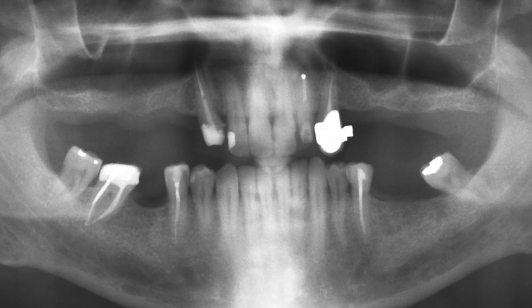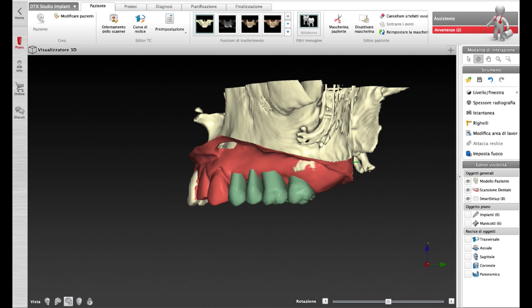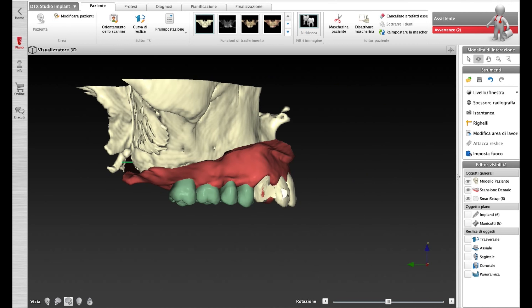Male patient missing all maxillary molars and premolars. Treatment planning involves left and right lateral sinus elevation without grafting material, with simultaneous replacement of six implants, three on each side.